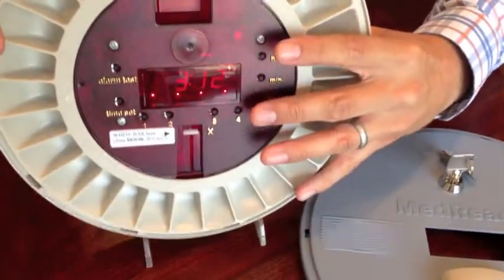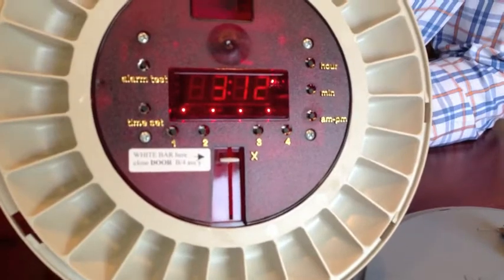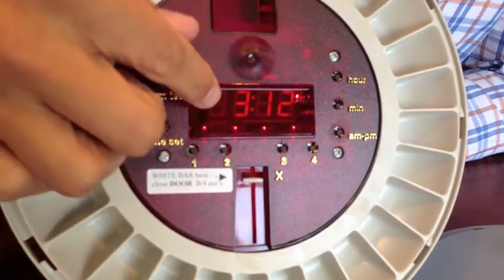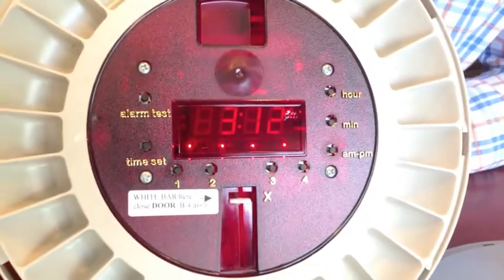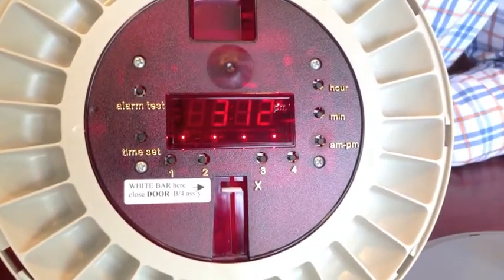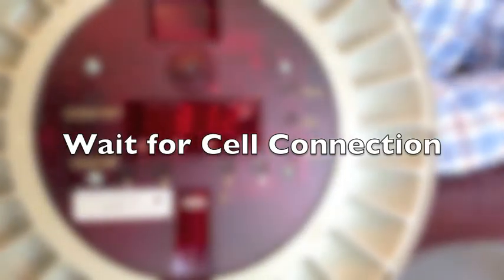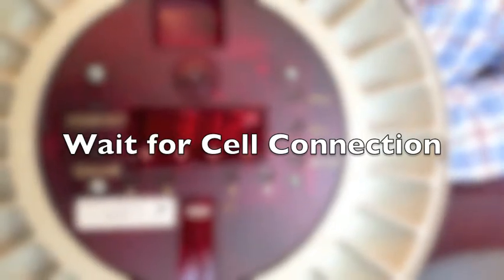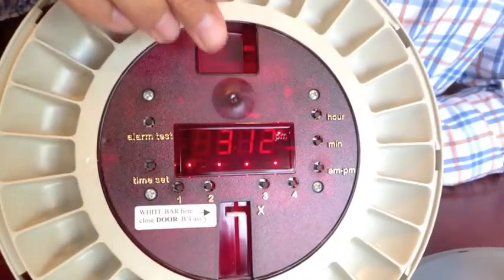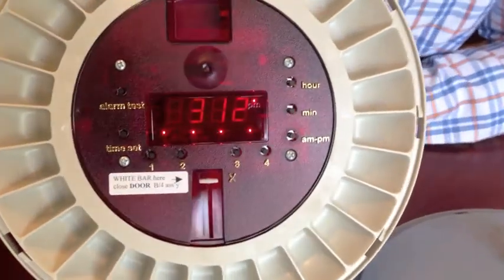Before you do anything else, you actually have to let the device connect up to the servers and download the correct time. If you look on the clock face here, we actually have the correct time. When you start out the first time, it's going to show you a time of 12 o'clock. You have to wait about 20 minutes before you do anything else — do not set any alarms or press any buttons on the device until you see it register with the correct time on the front. Once you've done that, you can commence with setting the alarm times.